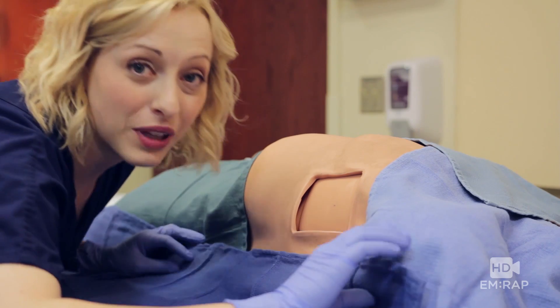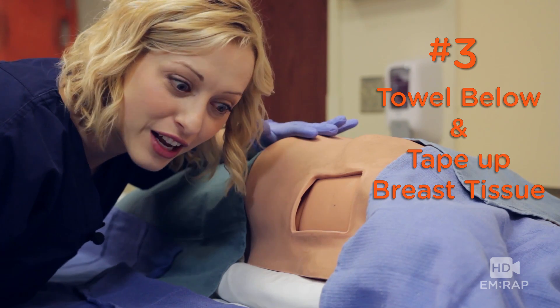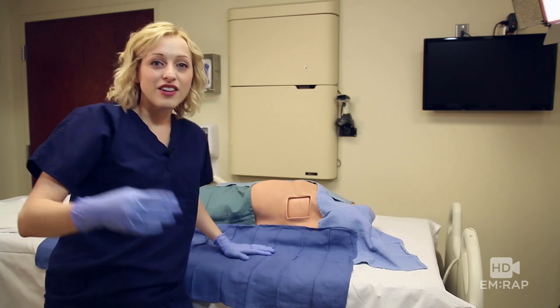Number three: place a roll of towels or sheets under the patient — this gives somewhere for the adipose to drape down and stay out of your way. Just like we ramp up our obese patients for intubation, ramp them up for a chest tube.